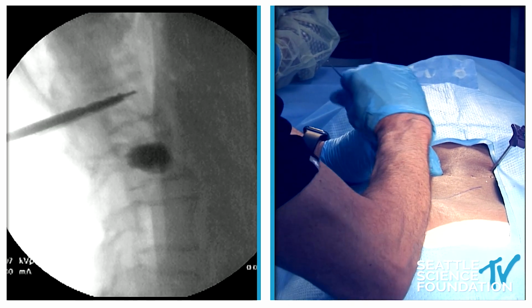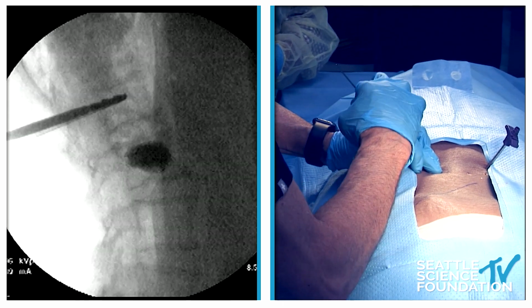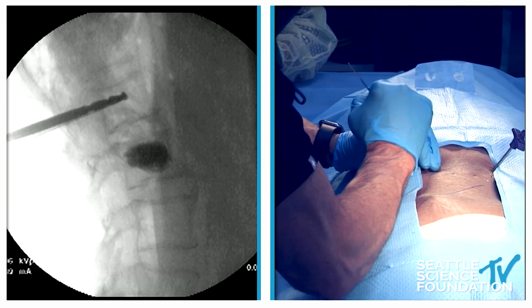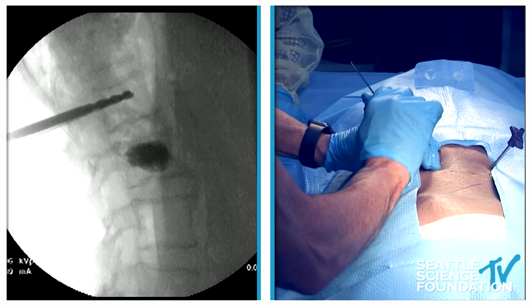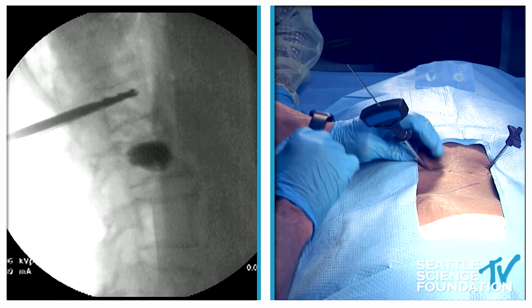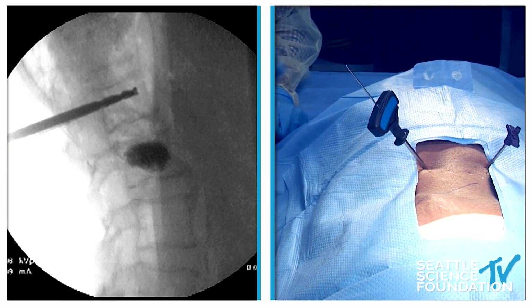And as the reamer goes through bone, bone can get stuck in the cannula hole, which will bind the guide wire and cause it to move forward as the drill moves forward. So you want to watch it very closely. All right, so I'm going to put this in place. That looks pretty good. We can see the size matched distal tip of the reamer. We'll put it up toward the anterior portion of the vertebral body. And I'm going to remove the K-wire.